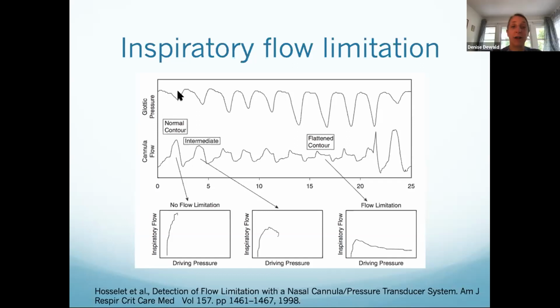Okay. Right. So this other thing to note is that normal airways don't require as much negative pressure. They hardly require anything. But people with sleep apnea can generate ridiculous negative pressures to try to inhale. Ridiculous being greater than -50, -80. Whereas normal is like -5, -10. Well, 2, 3. Even less. Yeah. Supraglottic is 2 or 3.